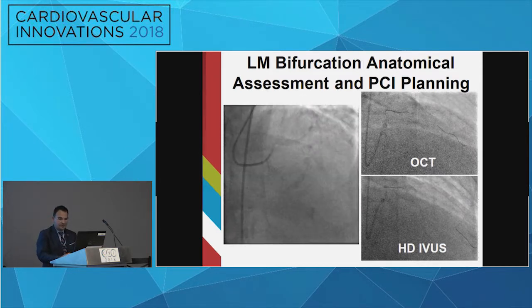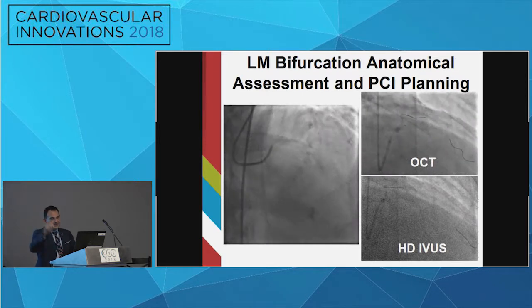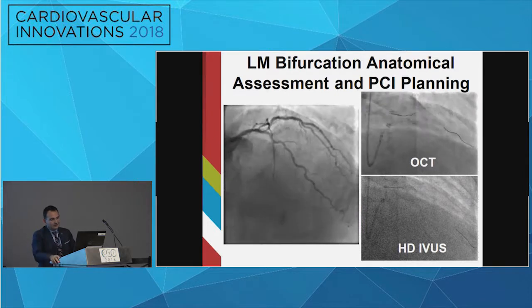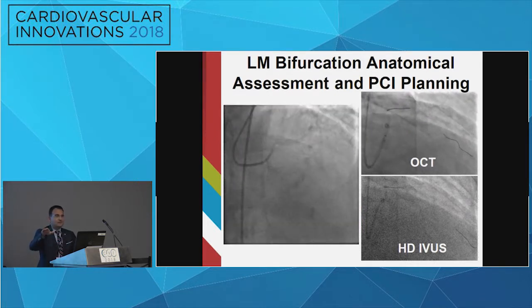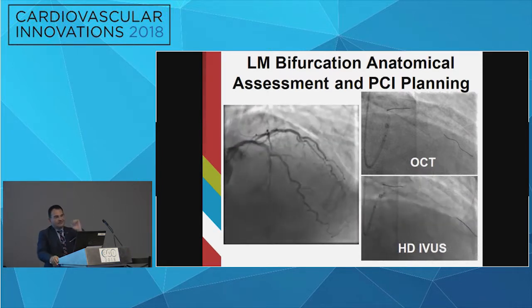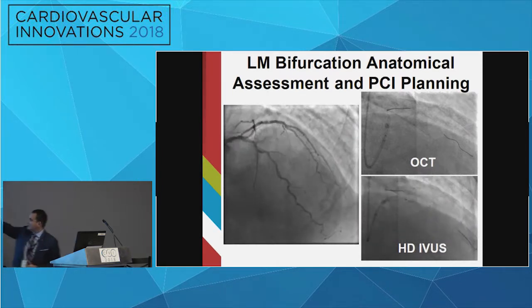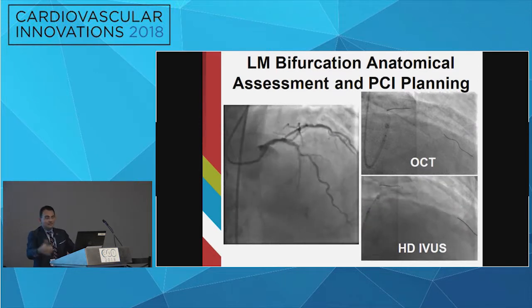So we started with an OCT shown here. So we advanced the OCT, but as you can see here, I have it captured live. At this curve, which was very highly calcific, we couldn't advance the catheter more. So due to the OCT catheter design, we ended up having our transducer into the guide. So this is the transducer of the OCT, that's the distal part, and that's the transducer part, captured, trapped into the guide. So we couldn't get any imaging.